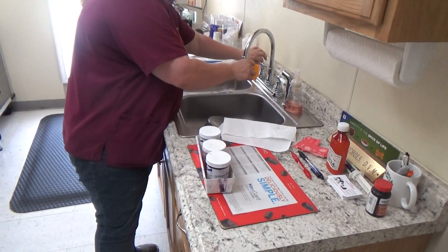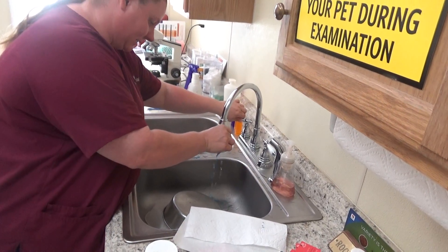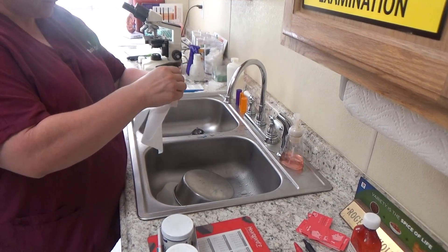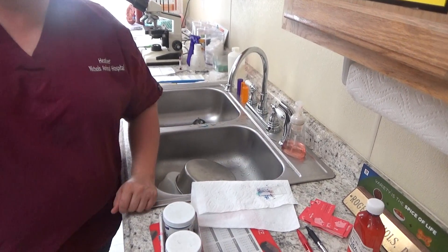I'm going to come to the sink and rinse off any excess that I have with a small stream of water. Now I'm going to dry the bottom off, and then let it sit here and air dry.